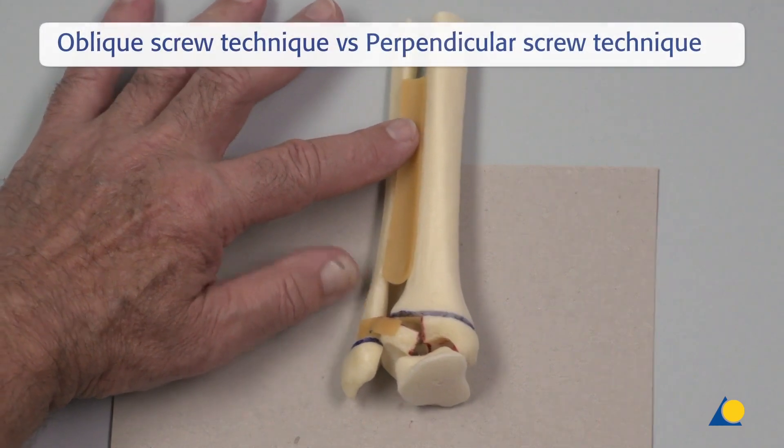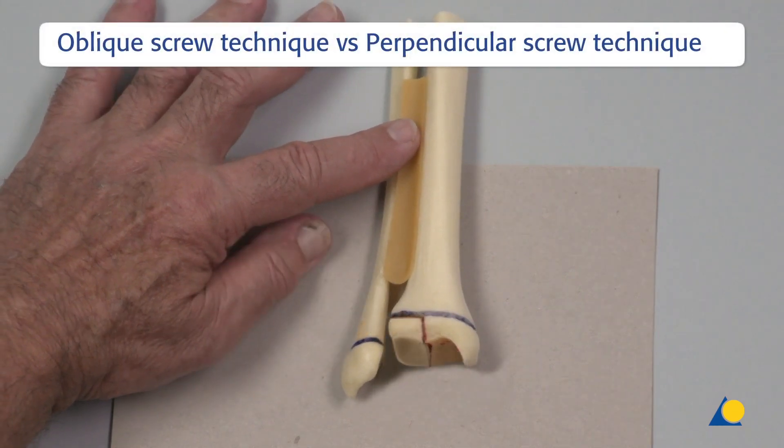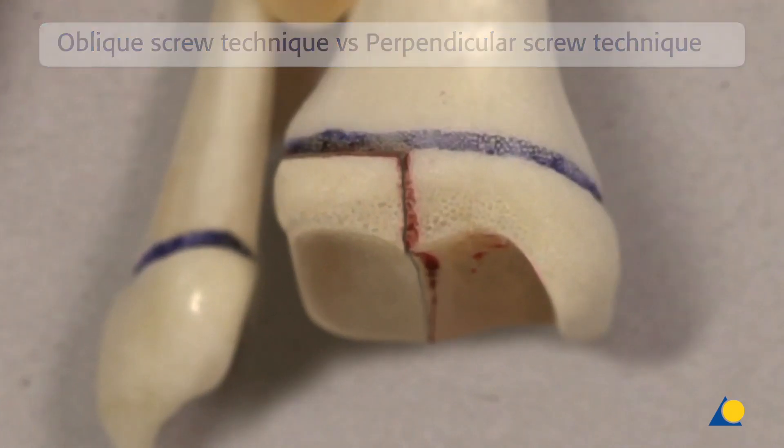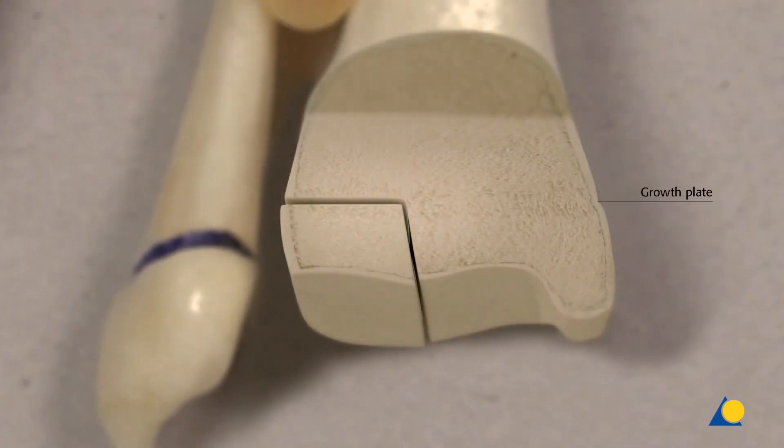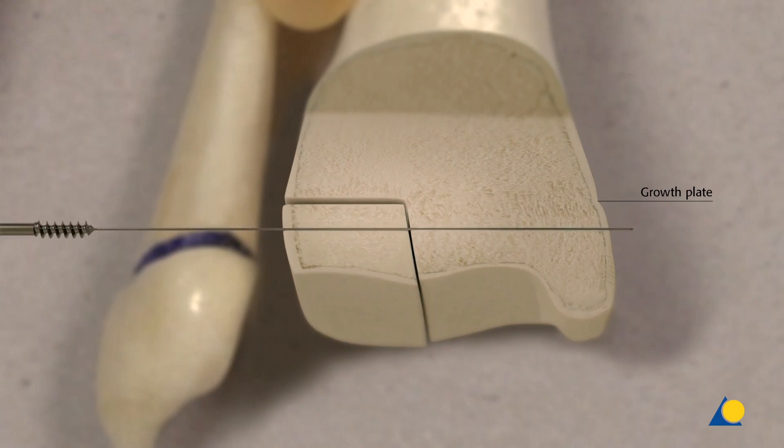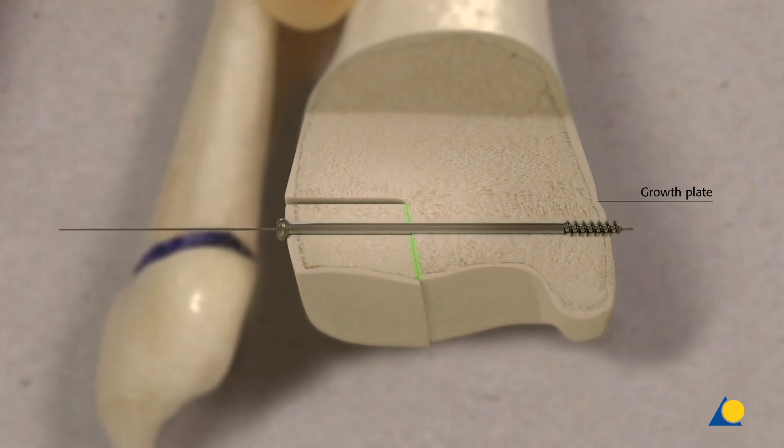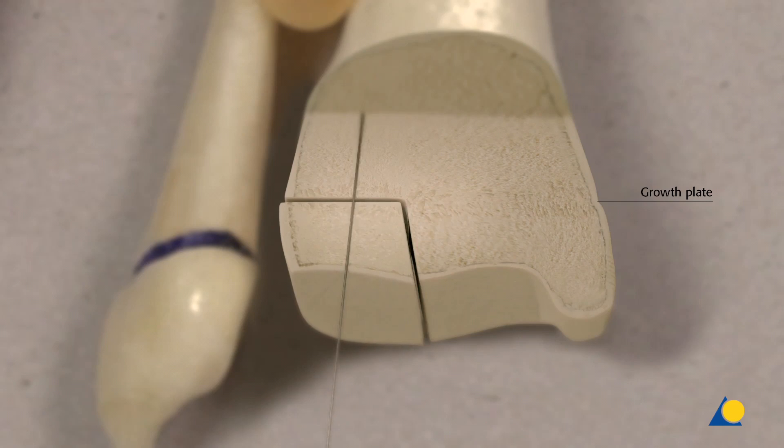In theory, the fragment displacement can be resolved using a perpendicular screw technique in relation to the Salter-Harris type 3 fracture line. This provides good compression of the fragment medially. However, if the fragment still has a step in the joint surface, this step will have been fixed and is a pre-arthrotic condition.